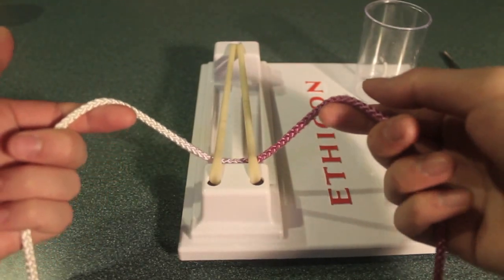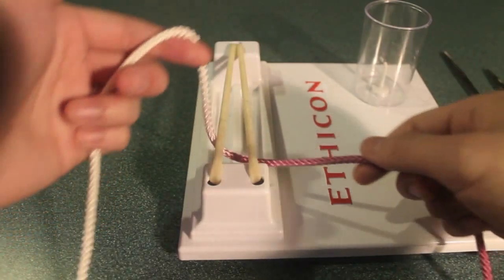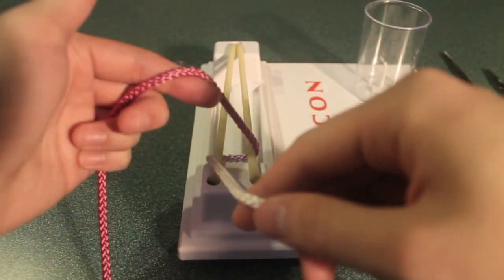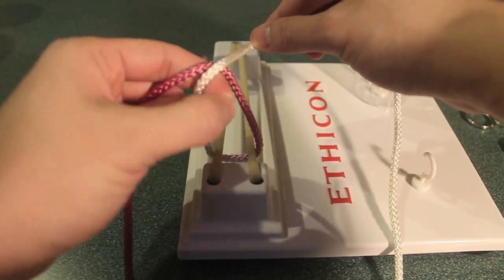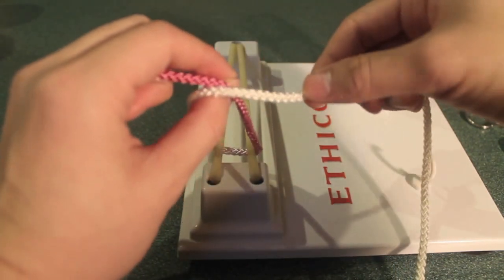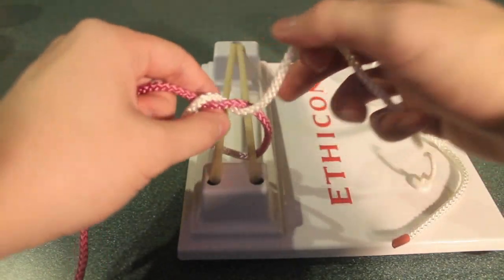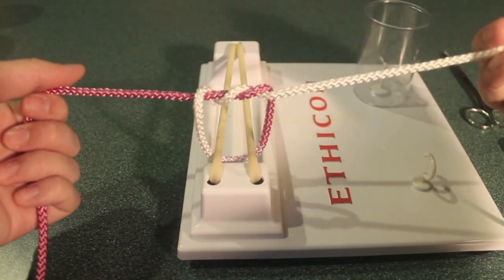The steps of making a surgeon's knot are almost identical to those of making a square knot with a two-handed tie. First, we start with the top suture in our left hand. We assume the pistol position with our left hand, and using our right hand, take the free end of the suture and place it over the index finger, creating our loop. Touch our index finger and our thumb together in the left hand and pass it through the loop. Slip the free end of the suture in our right hand in between the fingers, and then pass that free end through the loop towards ourself. The difference in the surgeon's knot is that we repeat this same step twice — we pass our fingers through the loop, grasp the free end of the suture, and pass that through, creating our two twists on the bottom.